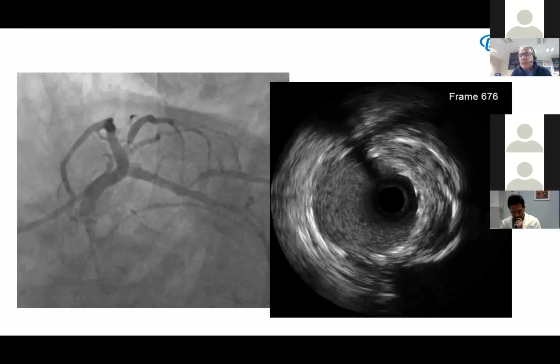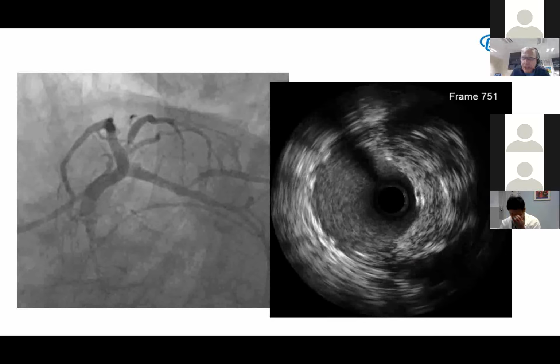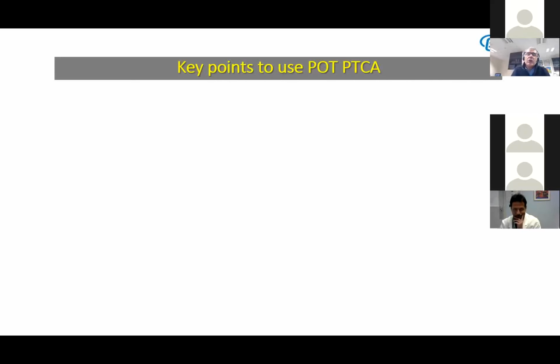This is a kind of demonstration where, with the combination of the technology that we have, the POT balloon, a very short balloon, with the IVUS, it is possible to resolve a potentially complex situation.